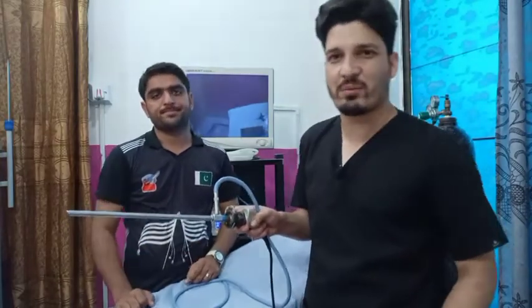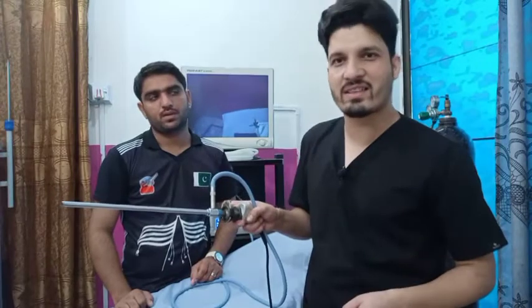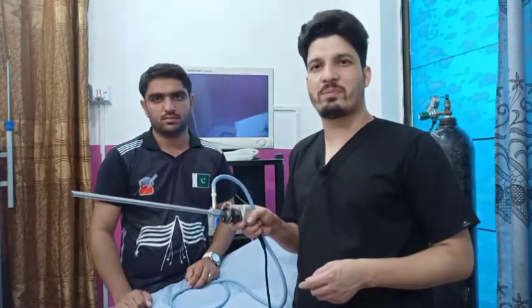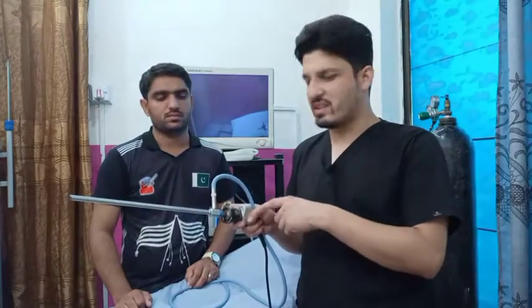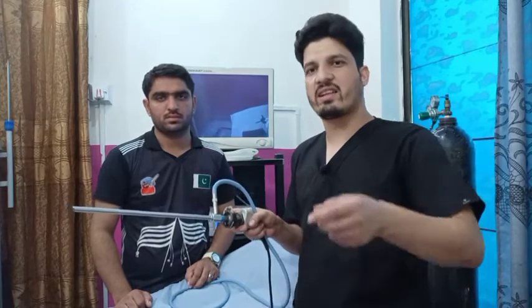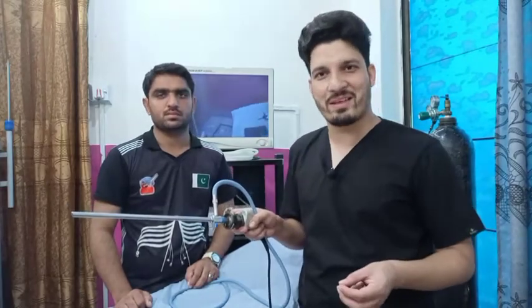There are two camera systems used in laparoscopy. This one I am using is the one-chip camera system. The other is the three-chip camera system, in which three chips are there for the separate three colors — red, blue, and green.